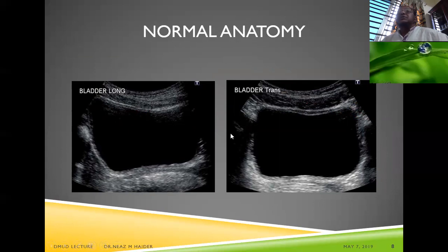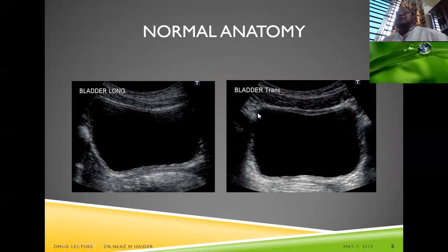This is the normal anatomy of the urinary bladder on a normal scan, shown in long section and short section. We can assess the bladder wall thickness, look for trabeculation within the bladder wall, and evaluate for other pathologies within the bladder.